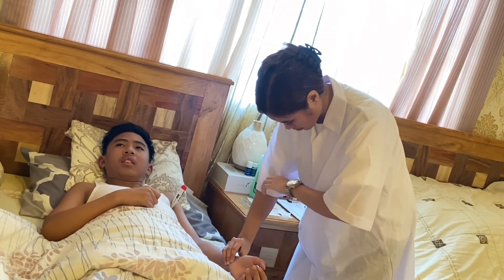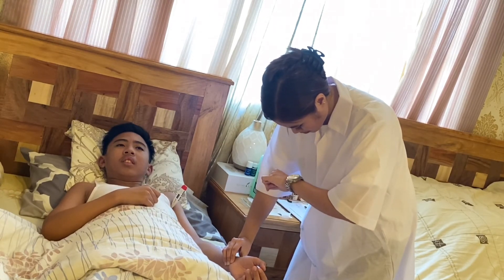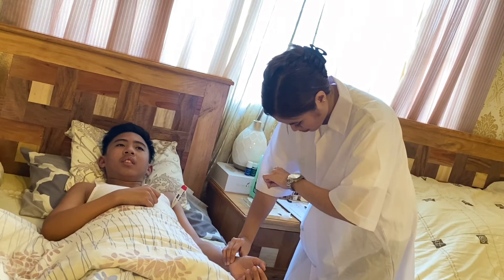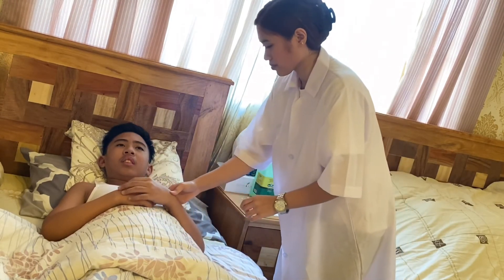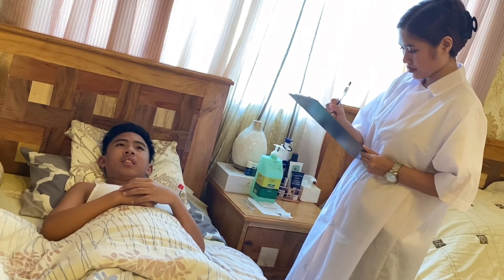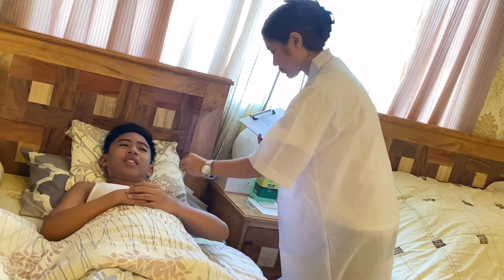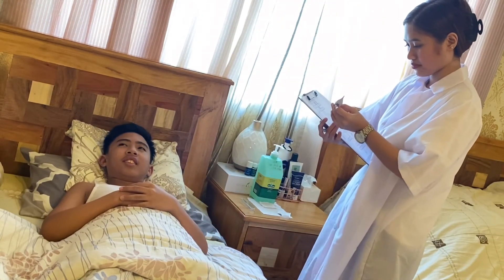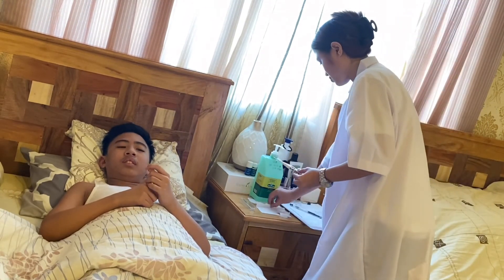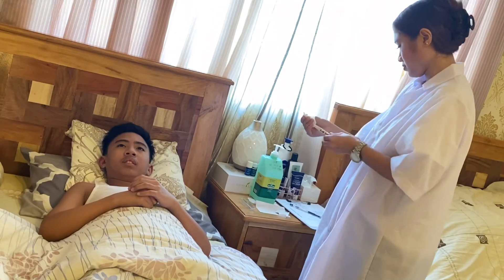Count for a full minute. Assess the pulse rhythm and volume. For documentation of temperature and pulse rate, document the temperature and pulse rate in the vital signs record sheet. Report abnormal results to the primary care provider. Document the procedure in the client's record. After using the thermometer, wipe it again with an alcohol swab from the body to the tip and discard the cotton. Then do hand hygiene.